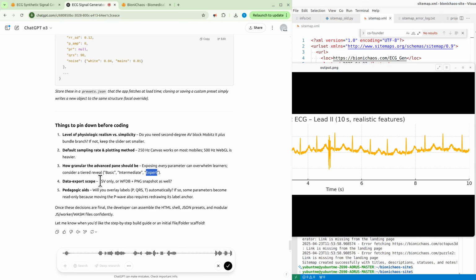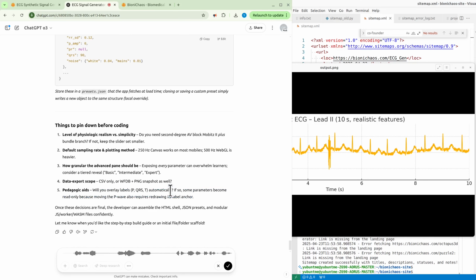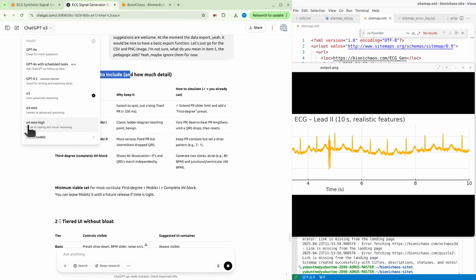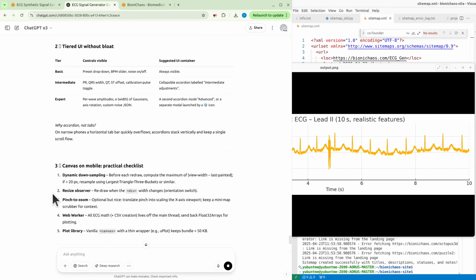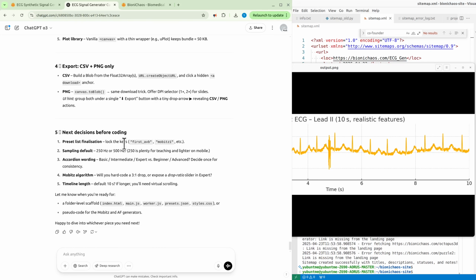Let's just go for the CSV and the PNG image. I'm not sure what you mean in item 5, the pedagogic aids? Yeah, maybe ignore them for now. It didn't actually do its reasoning business. Should we actually be coding with O4 mini high? Because it says it's great for coding. Not sure. Well, we also have GitHub Copilot.